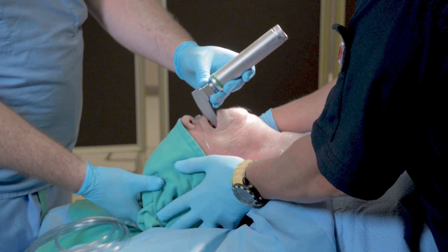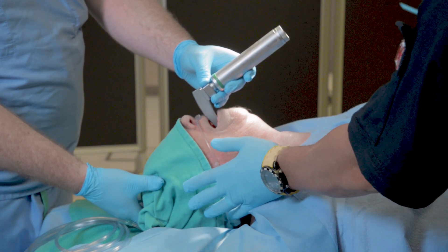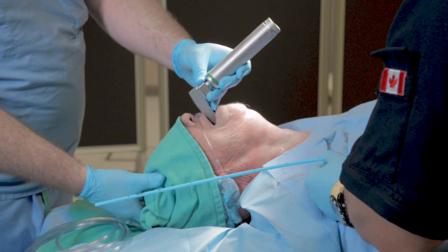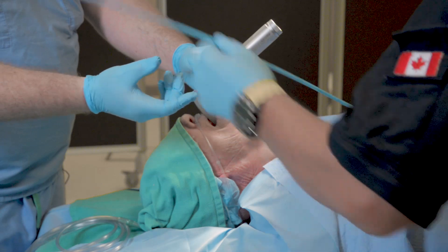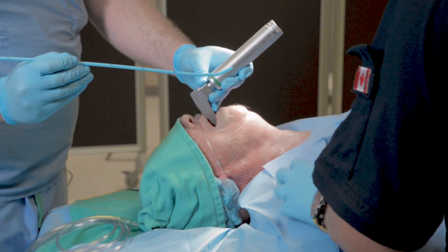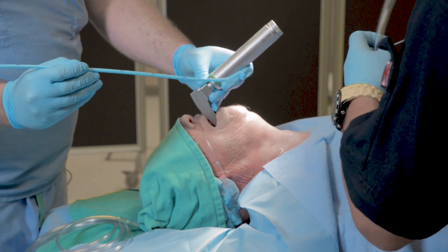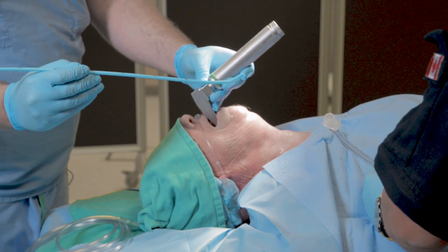Once the epiglottis is identified, we're going to ensure that the tip of the laryngoscope is in the vallecula, engaging the hyoepiglottic ligament, and lifting the epiglottis up out of the way. At this point, our assistant is going to pass a bougie. The bougie should be on the chest for every intubation — not as a difficult airway device, but essentially as a primary intubating device for those of us who infrequently manage airways.